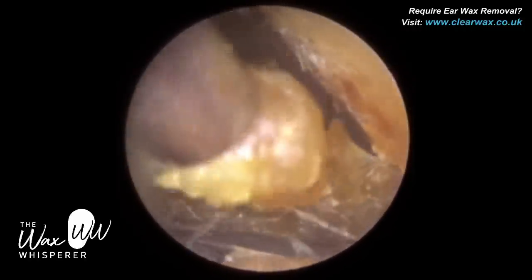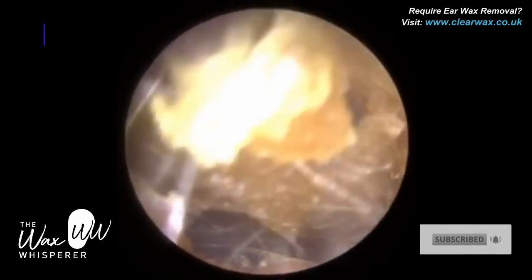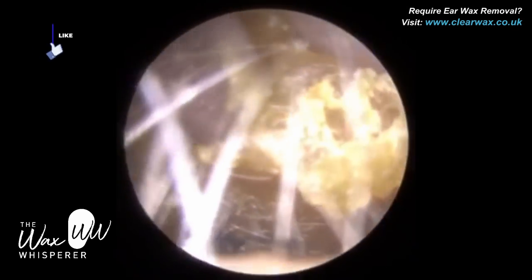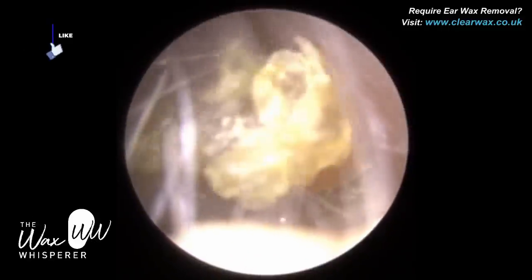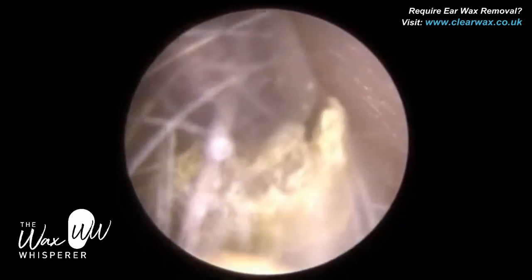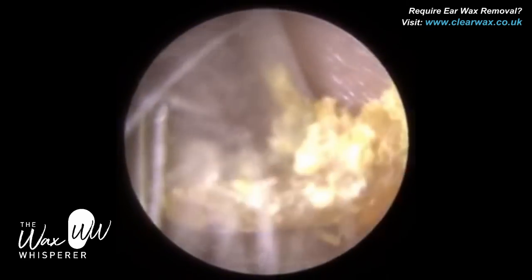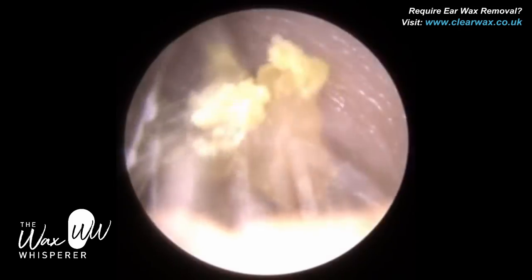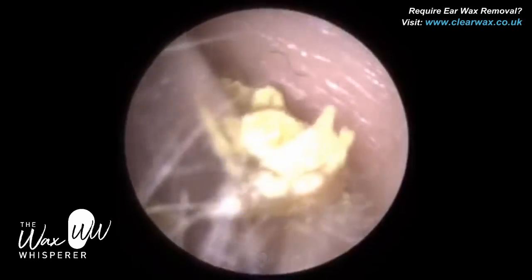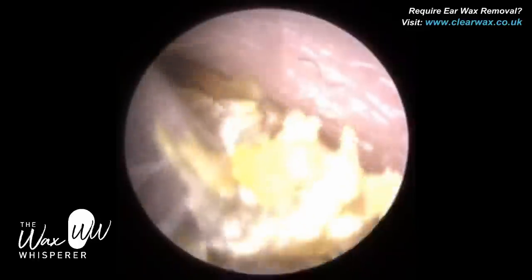What I'm going to do for this video is talk a bit more about depth perception, and in particular depth perception with an endoscope. I'm going to be removing large chunks of earwax from both ears. In this right ear, I'm also going to be using an earhook — I'll insert it just over the top of the wax, getting behind it to extract it. That's because this wax extends all the way to the eardrum.